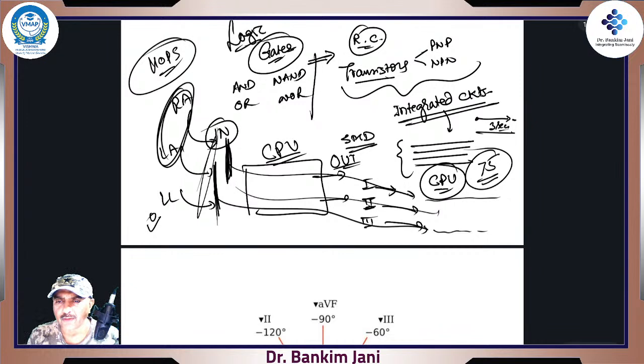All leads show some graph of ECG, then why are there different leads and what difference does it make seeing it through different angles? So Siddhan, that's right, in combination it works. And Aishwarya, the thing is, we want to see the heart from different angles because we don't know which part of the heart might be damaged, right? When we see the ECG, we really want to be sure which part of the heart is not functioning properly, because that will give us the entire prognosis.